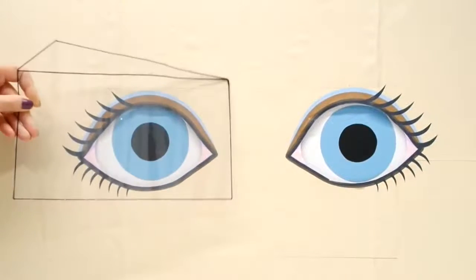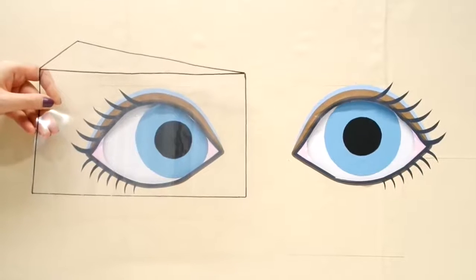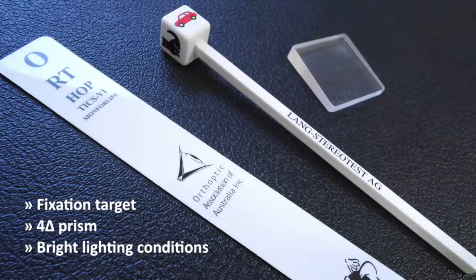When performing the 4-prism diopter test, a normal response is when you put the prism in front of either eye. The contralateral eye should make a conjugate movement out, resulting in diplopia, which then drives the movement back in to take up bifoveal fixation. For clinical assessments, you will need a fixation target for when the test is performed at near, a 4-diopter prism, and bright lighting conditions.